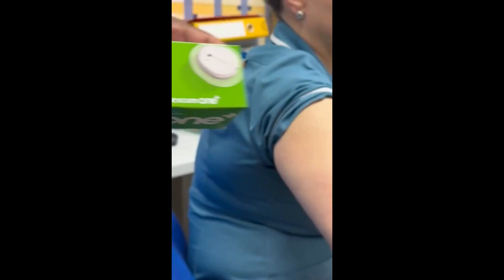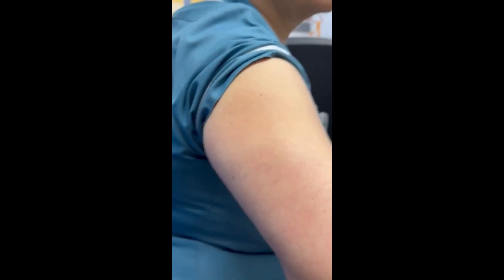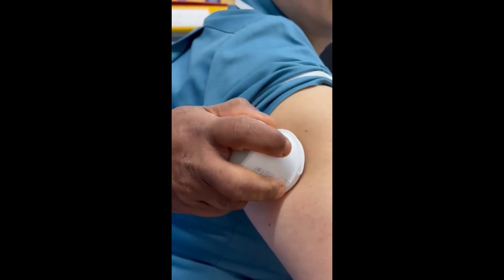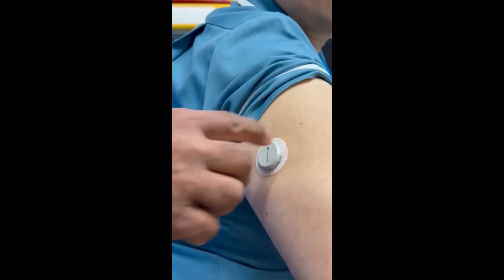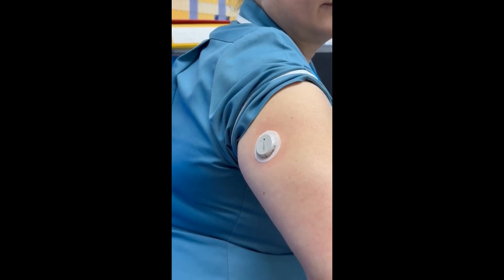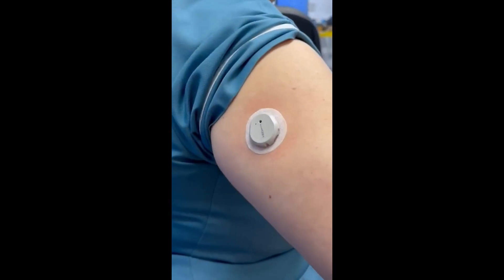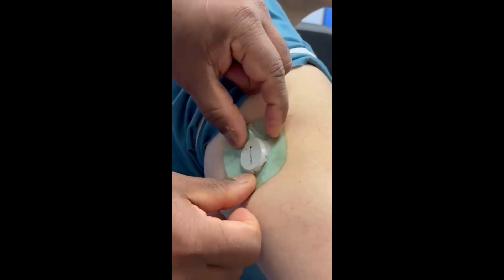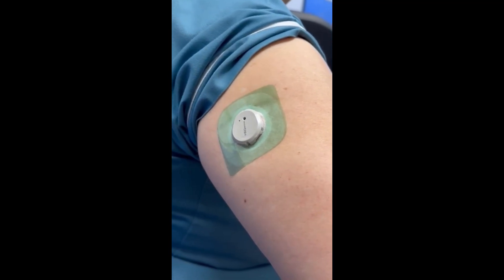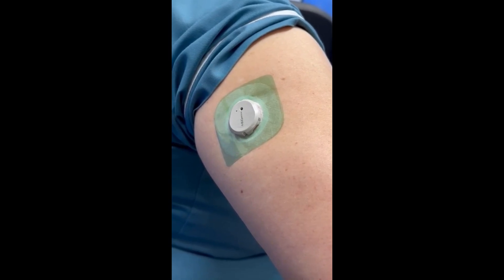Before applying your Dexcom ONE+ sensor, make sure the site is clean and dry. Use an alcohol wipe to gently clean the area and let it dry completely. You can apply the sensor on the back of the upper arm or your abdomen — these are the recommended sites. Once applied, make sure all edges are secured properly. For extra protection, you can use an over-patch or protective cover, especially if you are active or sweat a lot. Use the pairing code to activate it in the Dexcom app. After about 30 minutes of warm-up, your sensor will start showing glucose readings and you are ready to go.